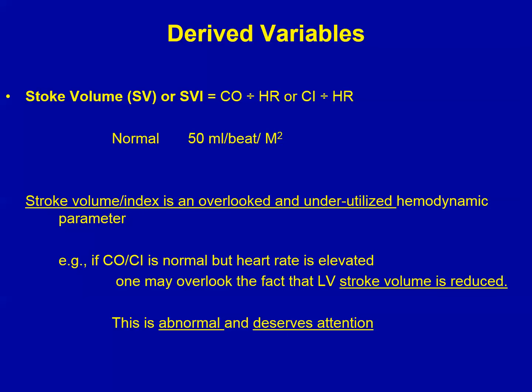The stroke volume is an overlooked and underutilized hemodynamic parameter, because if cardiac output or index is normal but heart rate is elevated, one may overlook the fact that in fact stroke volume is reduced. This, of course, is abnormal and deserves your attention.